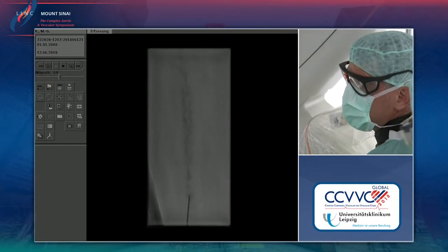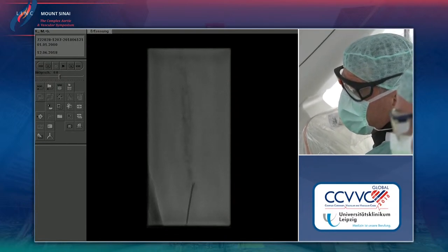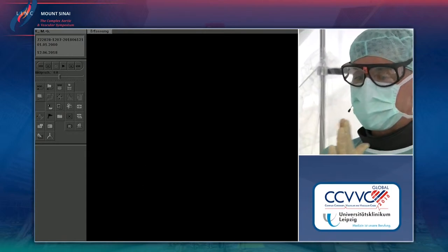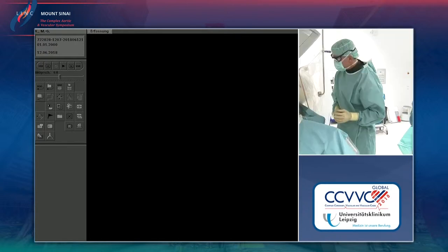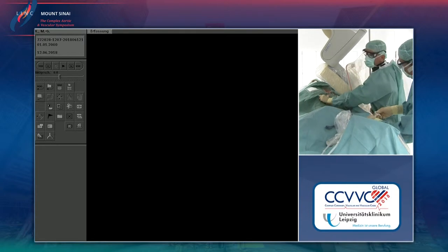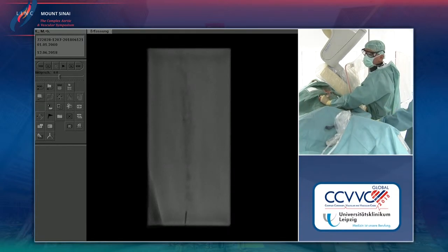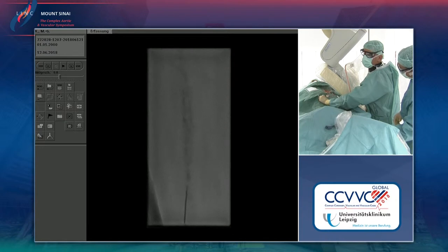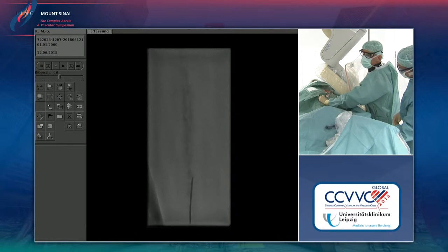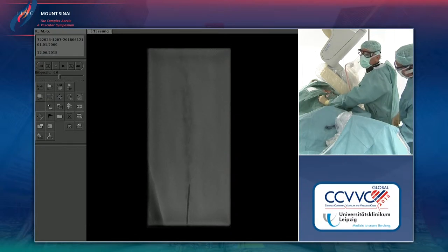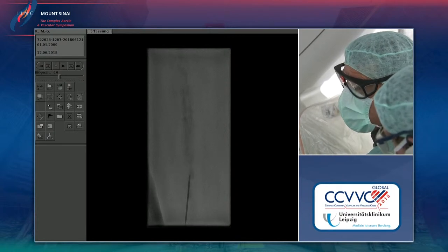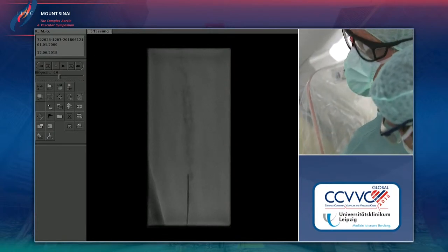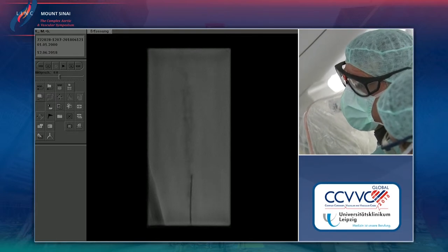The suggestion is made to puncture two centimeters lower. However, if I puncture lower I have a steeper angle into the artery, so potentially I try to puncture proximal to that calcium a little bit. Hopefully the needle is long enough. Here there is even more calcium. This is a nine centimeter length needle. I also have a 15 centimeter long one which could be helpful. It's so calcified, it's incredible.